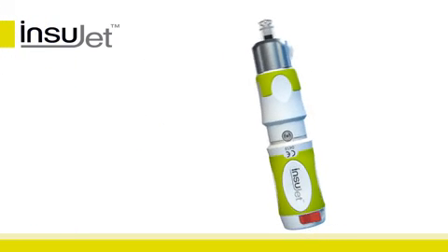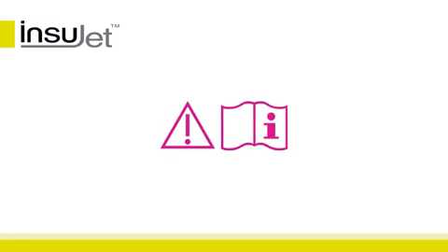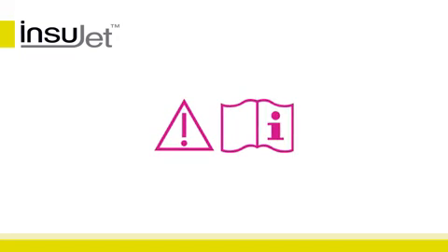Place the nozzle cover back on the nozzle and store the Insujet for next use. Please note: besides looking at this instruction video, read the instruction manual carefully before first use.